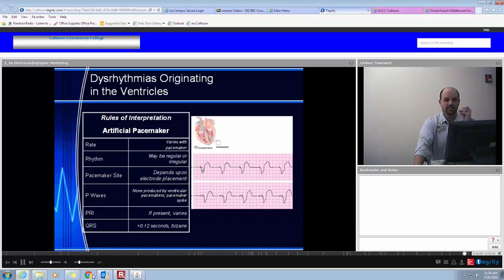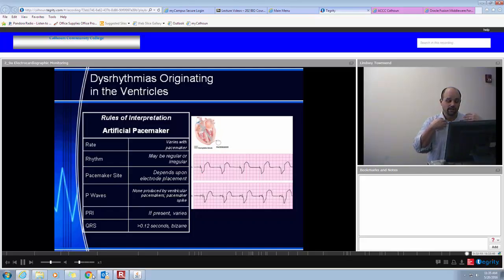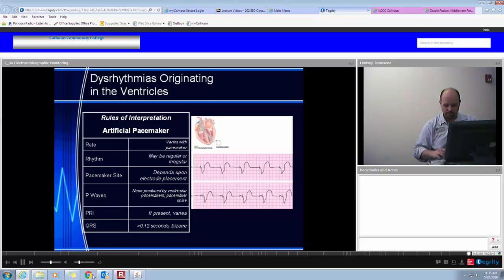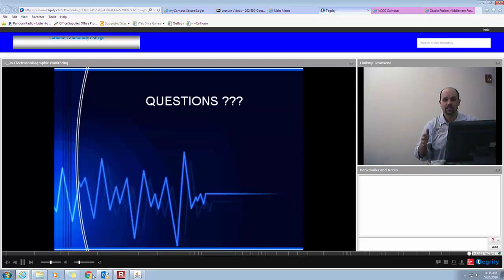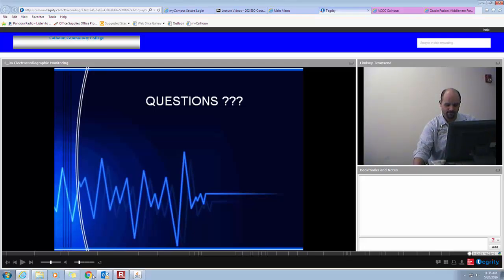The next one is our only true arrhythmia. The term arrhythmia means no rhythm, and there's really only one true arrhythmia: asystole. Asystole is flatline — nothing is working. The SA node, the AV node, the Purkinje fibers — no electrical activity. This is a clinical sign of death. If we don't stop a fibrillating heart in time, once it uses all its stored energy it'll eventually go into asystole — flatline, no sign of life. You can see here the classic asystole on the tracing: flatline.